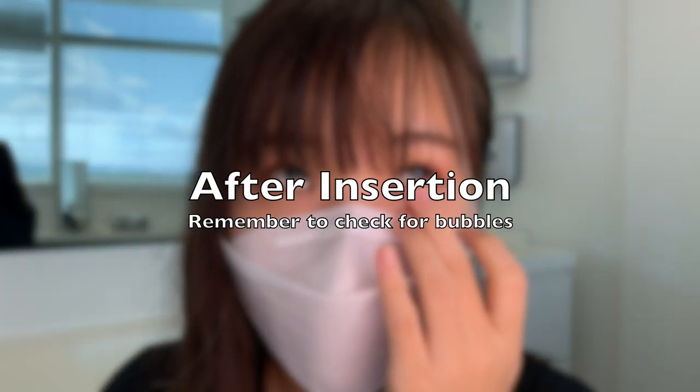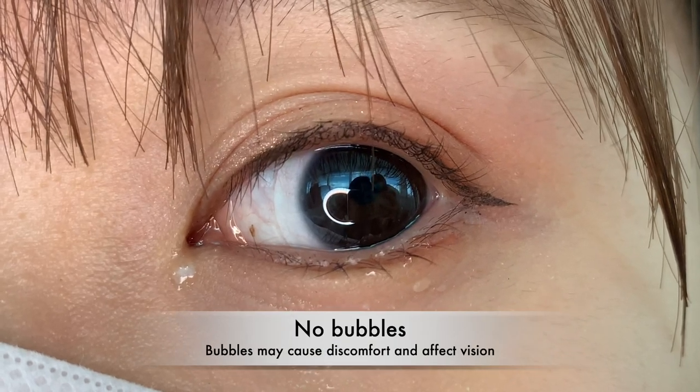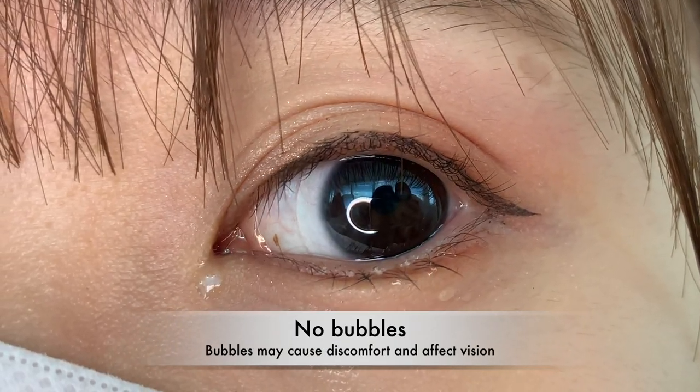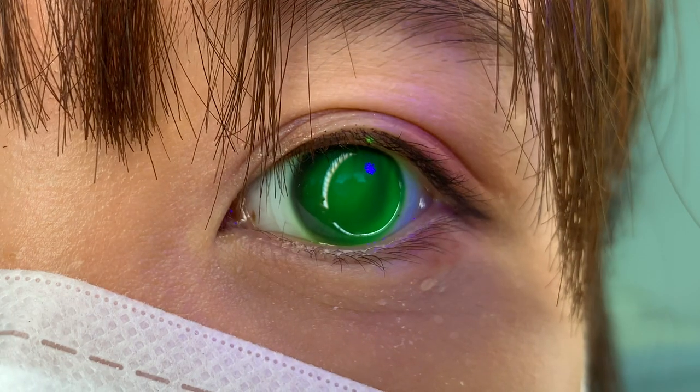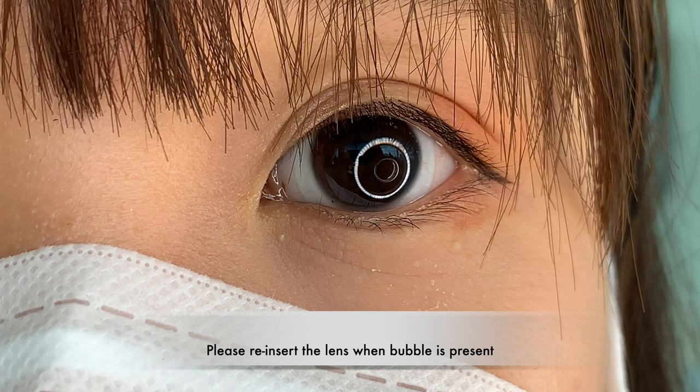After inserting the lens, check if there are any bubbles formed. Bubbles may cause discomfort and affect vision. This is what it looks like when there are no bubbles under the lens, and this is when there is a bubble under the lens. Please reinsert the lens when a bubble is present.